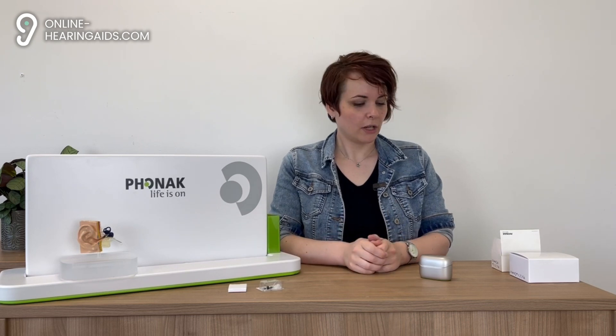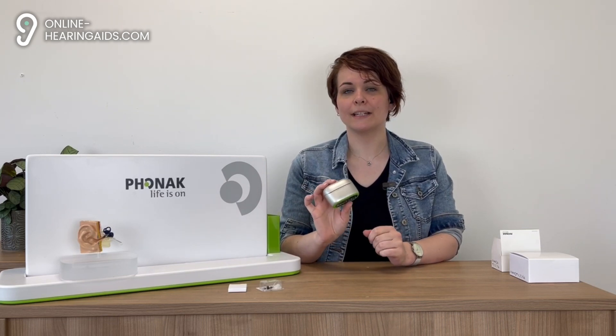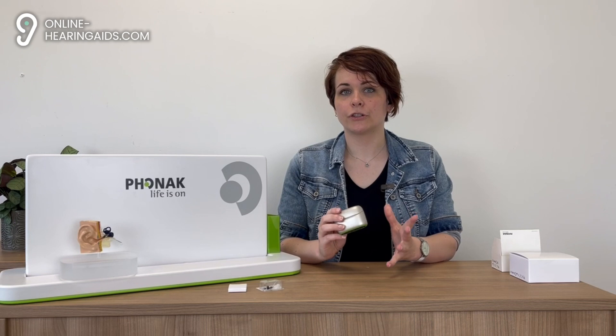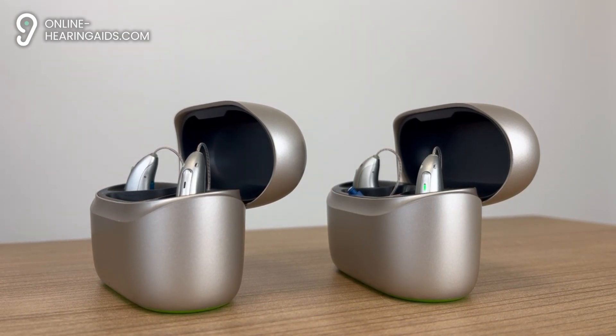Charging the Infineo R and the CROSS Infineo R can be done in two ways: with the Phonak Charger Go RIC Infineo, that allows you to charge the hearing aids even on the go thanks to the built-in power bank, or with the normal Phonak Charger RIC Infineo.